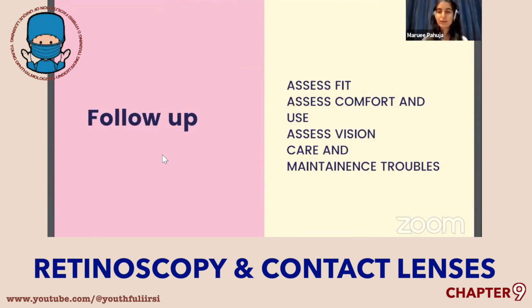After we've determined that the patient is happy to take the contact lenses home and knows how to take care of them, you do a follow-up after a week where you assess again the fit of the lens and the comfort. When they're back home, how are they using the lenses? How many hours are they wearing the lenses? Are they compliant with the teach that you've given? Make sure to ask them to do exactly what they're doing at home. You will see a lot of patients will not wash their hands when picking up their lenses and putting them in, in the clinic. So you have to remind them of these very important steps that need to be done when wearing contact lenses, check the care and maintenance, and reiterate the importance of why we're doing this.